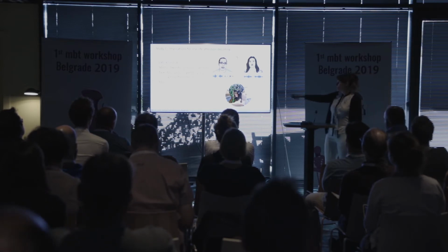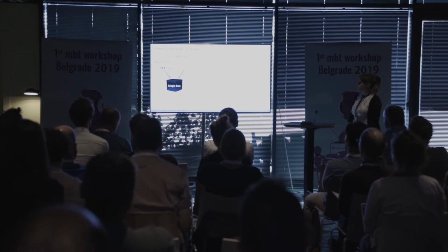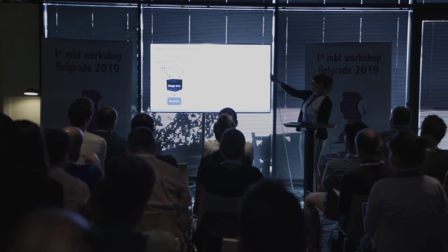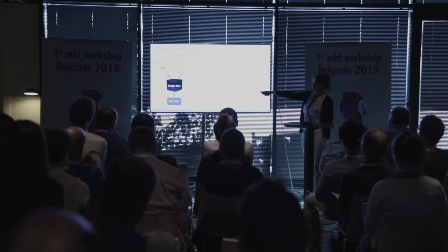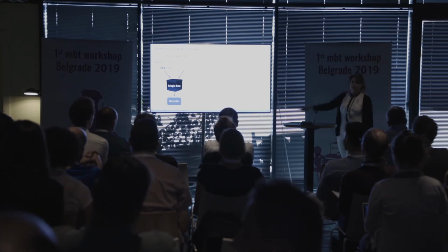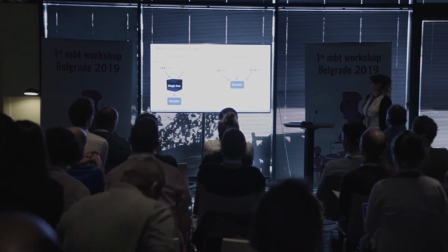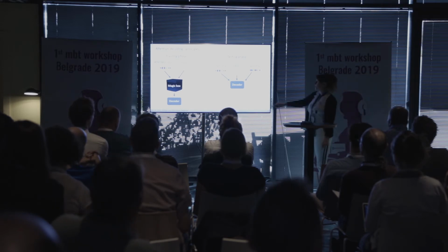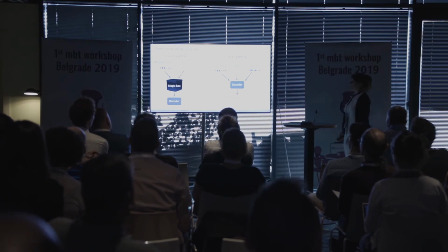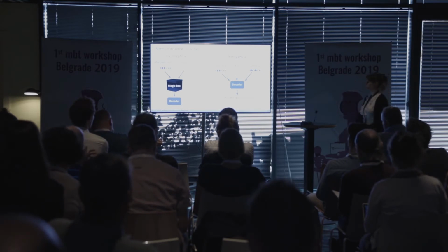So we have some setup, we record brain waves, we have two speech streams. So we can train some sort of a decoder, basically. We put the attended speech into some algorithm, and we put our concurrently recorded EEG, and a decoder comes out. Later, we can use that decoder to basically decide which of the two speech streams the participant is listening to. So it's going to decide whether it's speech 1 or speech 2, if we give it both speech streams and EEG.